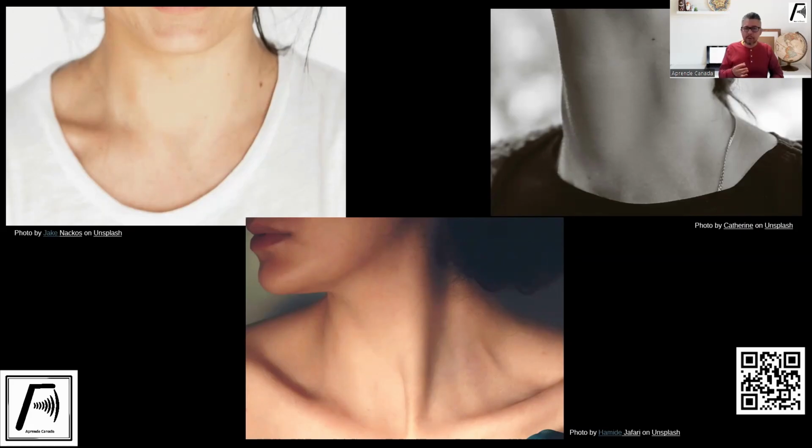It may or may not get rid of it in the sense that you may still identify it. However, the idea is to move that shadow, that edge of the muscle, away from where you're looking at, right? And so by doing that, obviously you can fully assess the area that you're looking. And then you may have to do this movement many times as you're moving to different areas of the neck.